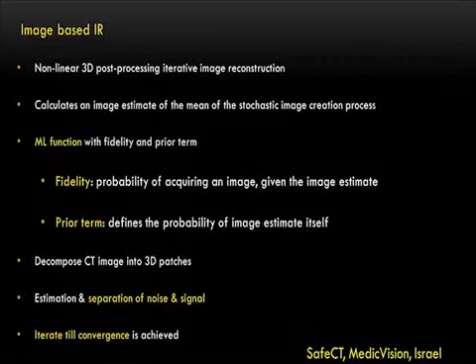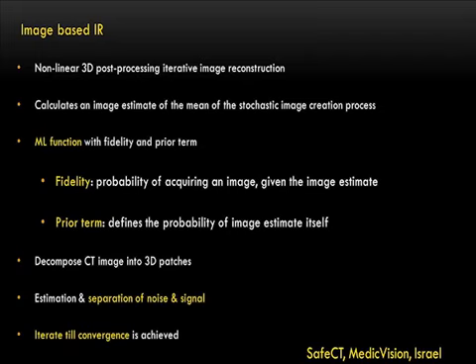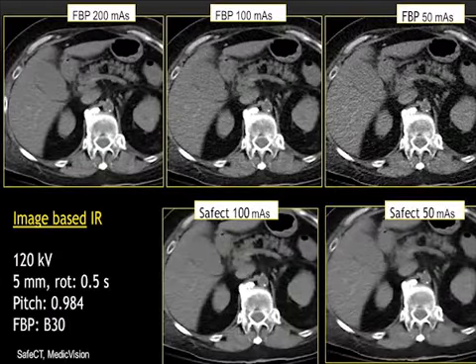And let's move to another vendor, which is Medic Vision from Israel, and they have this image-based IR. Instead of going into detail of the whole algorithm, they have some sort of maximum likelihood function, a fidelity term, a prior term, and then decompose the CT images into 3D patches and then estimate the noise and separate the noise.